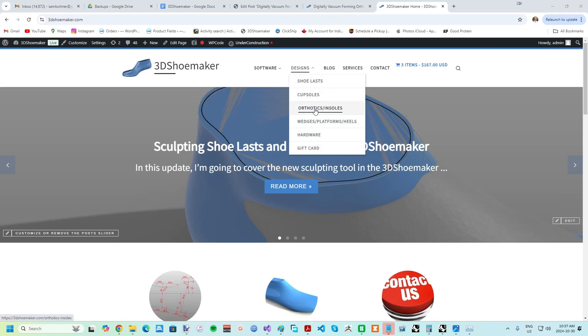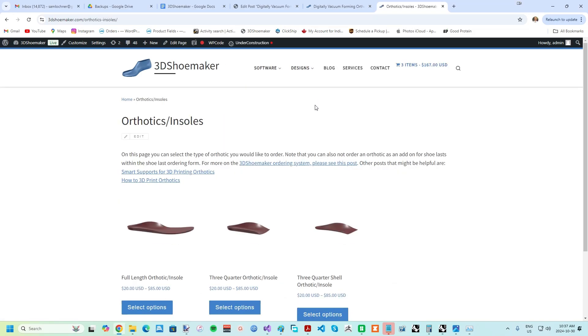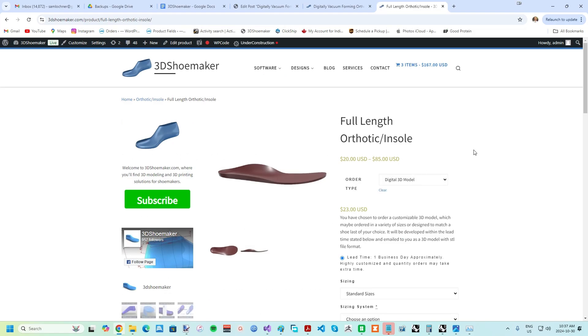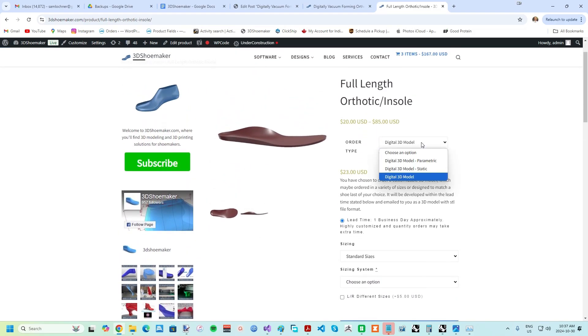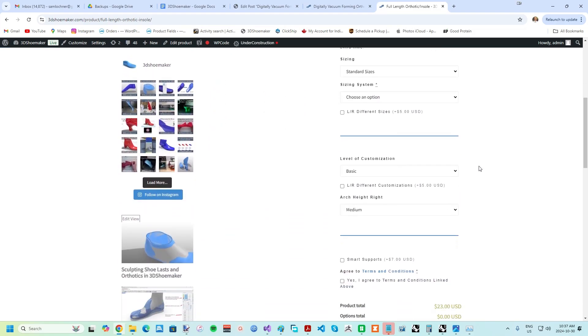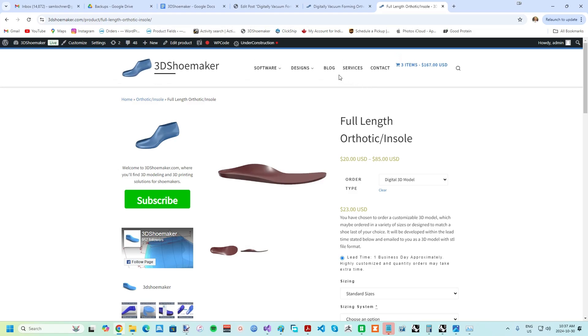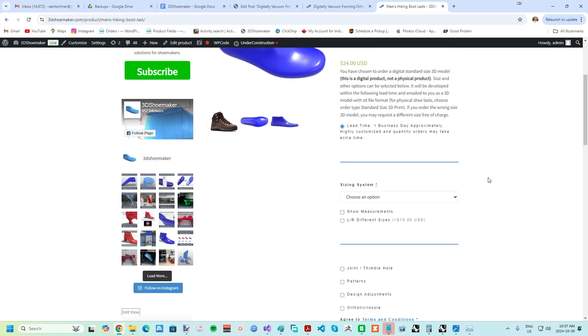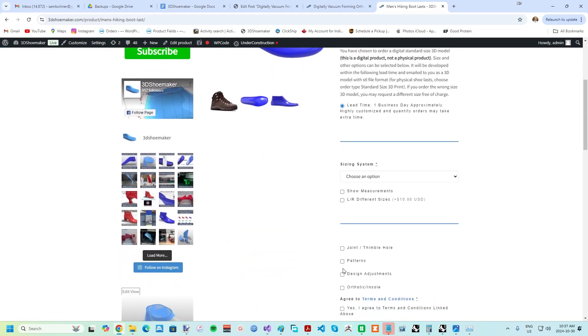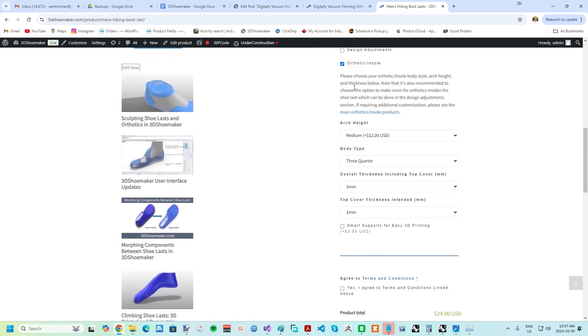Before getting started with the new vacuum forming tools, I'll first point out to those simply looking for 3D printable orthotics to put in shoes that these can be found on 3dshoemaker.com via the Designs drop-down. There is a link to an explanation on the ordering system, and orthotics can now be ordered as add-ons for shoe lasts too, within the ordering form for shoe lasts.